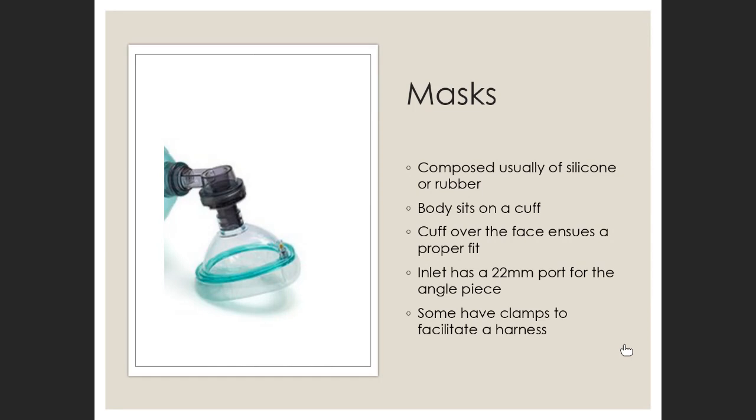Bijan, your turn. Which do you think is easier to place? I would say the laryngeal mask. Okay, Bernardo, your vote. Endotracheal tube. That's 1-1. Gay, you're counting? Okay.